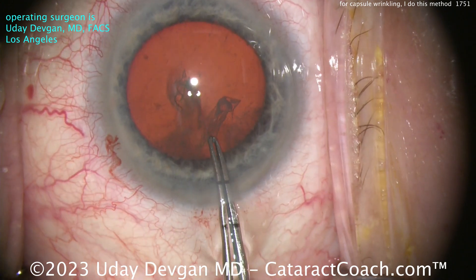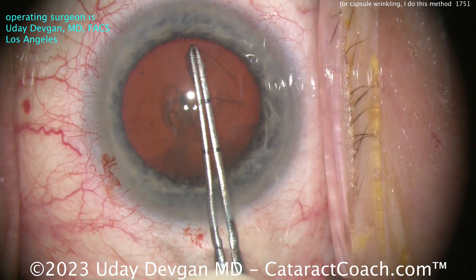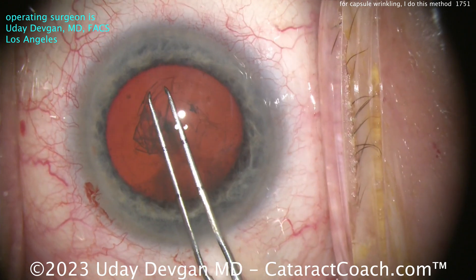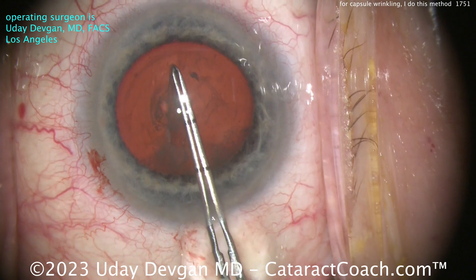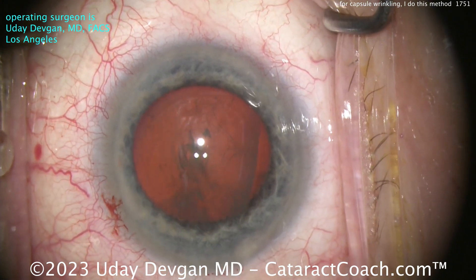That can happen — this patient is mid-80s. Getting the rhexis done nicely, flipping that around. You want that exact five millimeter rhexis, so I'm taking my time. As I'm carrying the rhexis, there is no further wrinkling, so I'm probably not going to need a capsular tension ring in that eye. There's the five millimeter rhexis.